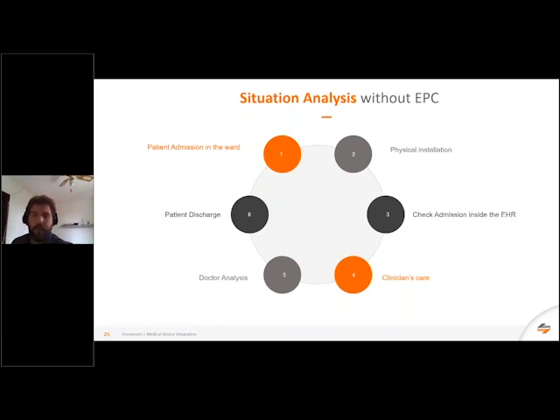The patient can leave the ward sooner. Then the doctor, by reading the health evolution of the patient through data report and communication with Sarah, can analyze the situation and make a decision. Finally, the patient can be discharged from the ward. Sarah knows that her actions, even if it's boring, are crucial for a patient's care episode, as the doctor needs vital information to take the best decision.